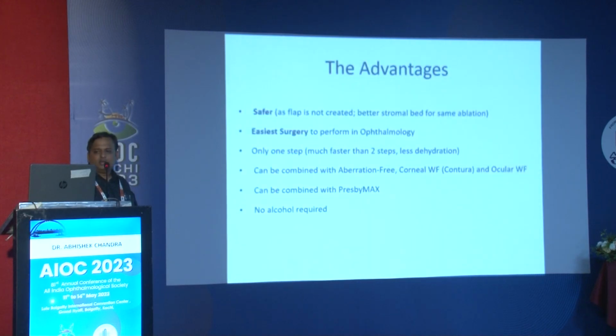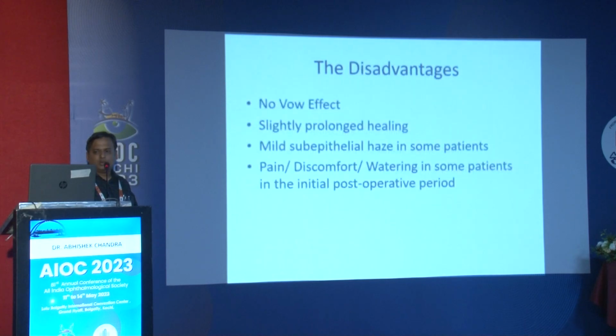So just to conclude, the advantages are it is much safer, easier surgery to perform, only one-step surgery, and it can be combined with aberration-free corneal wavefront or Contoura or ocular wavefront, and it can be combined with Presbymax, which is for presbyopic correction, and no alcohol is required.